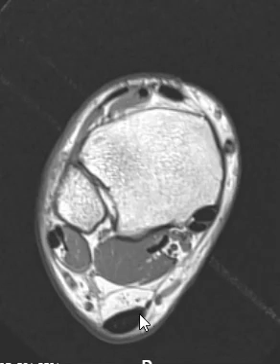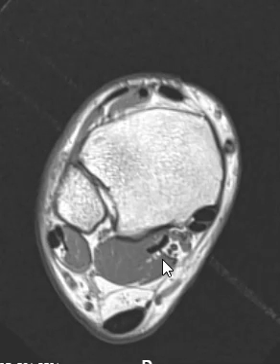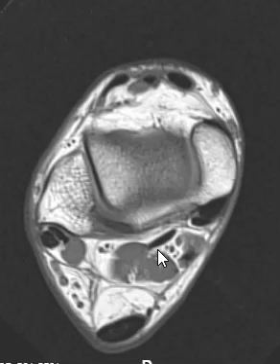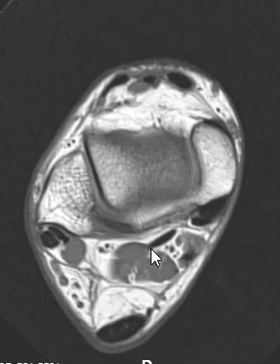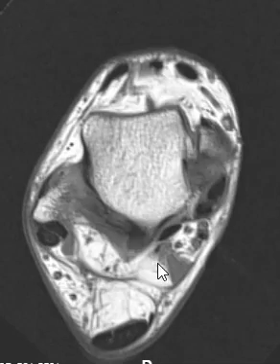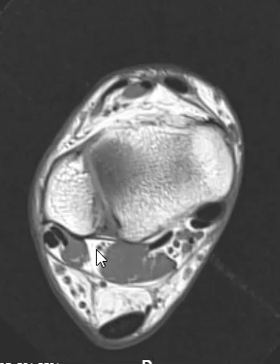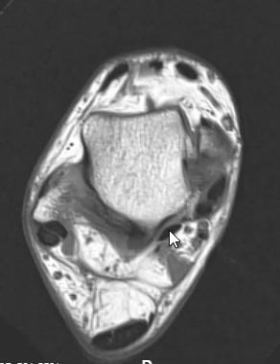If we look in the ankle here on this T1 weighted image, we see the Achilles tendon. In front of that we see the flexor hallucis muscle, and this is the central tendon. If we go down, the tendon is right here and the muscle disappears, but this is the accessory muscle along the medial aspect of the flexor hallucis.